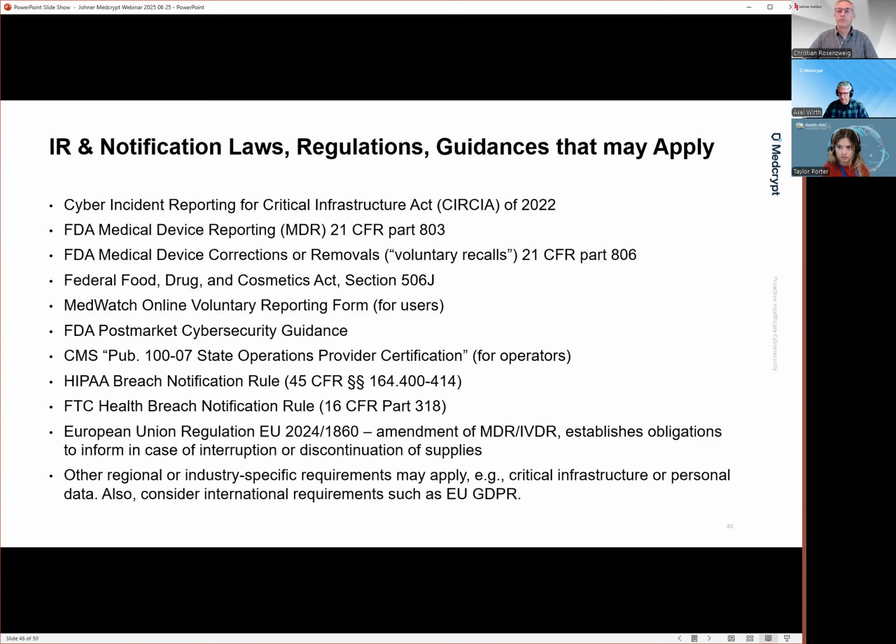Whereas in the post-market, you typically have a lower volume, but each individual identified vulnerability will probably require a more careful analysis, for example, from a patient safety perspective. So there are some differences in process, but from a general tooling perspective, you can certainly make it work.